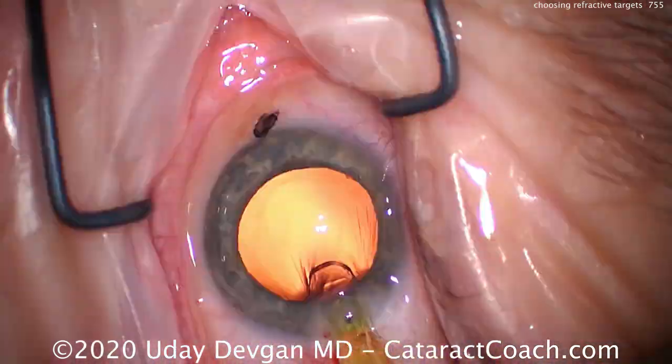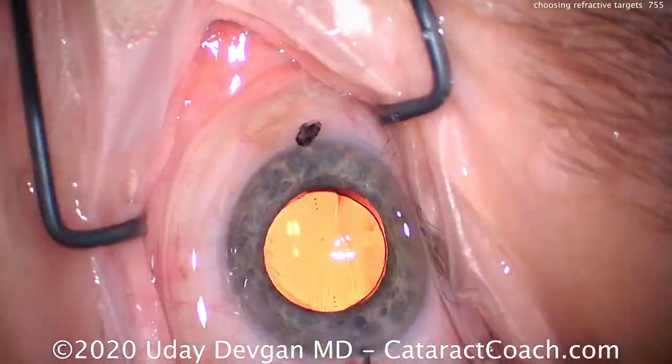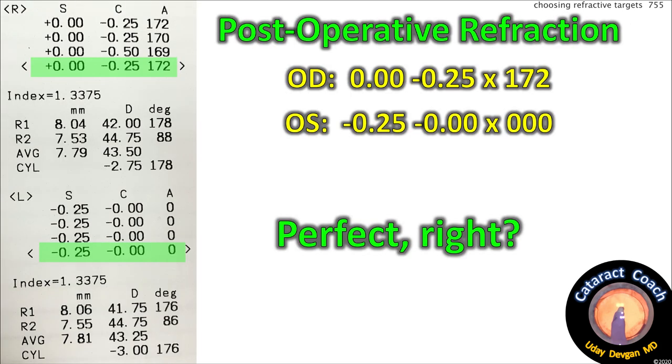Time to insert the IOL. There's the lens going in the capsular bag, dialing it into the correct meridian. Here's the post-op: toric lens, beautifully centered and rotated to the correct axis. It very nicely balances out the cornea. Post-op refraction: right eye plano, left eye plano.